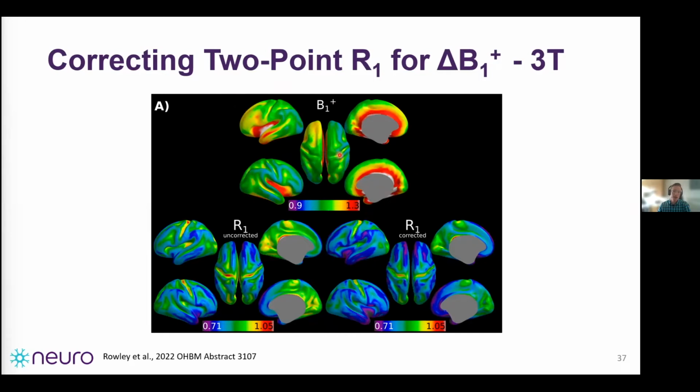Here at this site, we see much more left-right asymmetry. Again, we want to make sure we correct for these hardware issues. Otherwise, we might report left-right asymmetries as being real in imaging data and put that onto clinical populations when they might not truly exist. So in the uncorrected data versus corrected data, we see a flip.